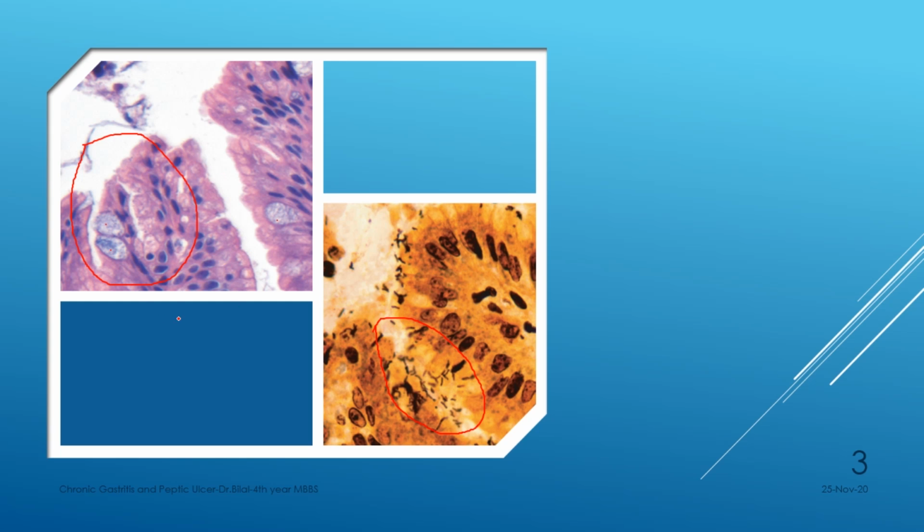When you see these in a scenario where the main diagnosis is chronic gastritis in your opinion, and you're given this picture that this is a complication that has developed. So this is it, this is intestinal metaplasia. These are the goblet cells that can be seen here.